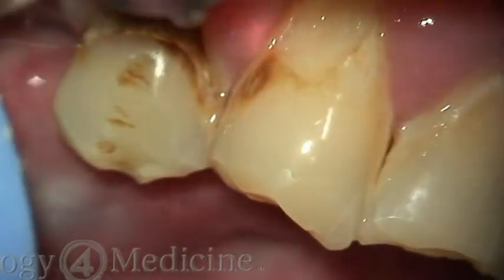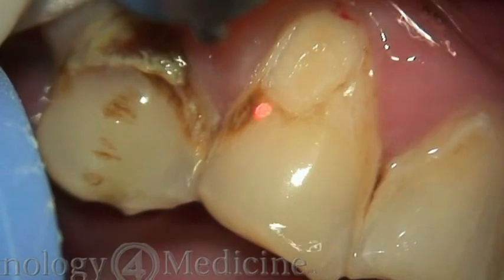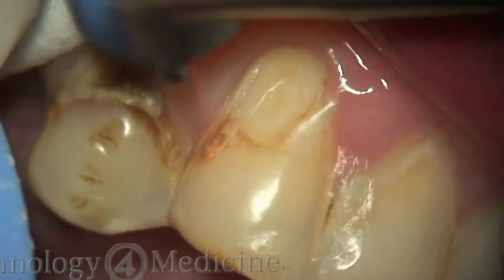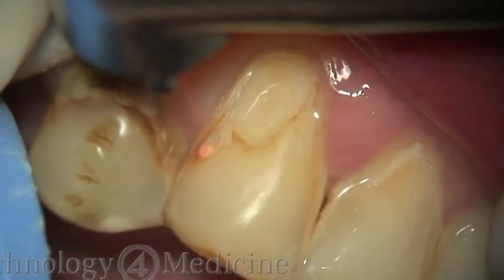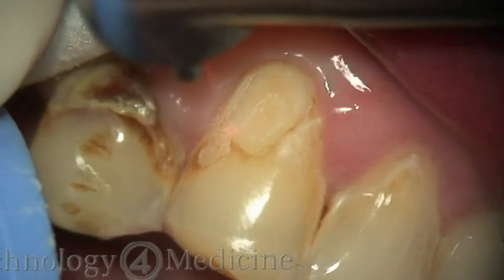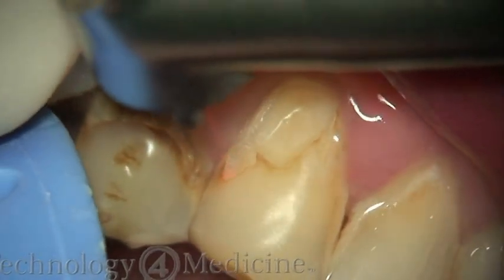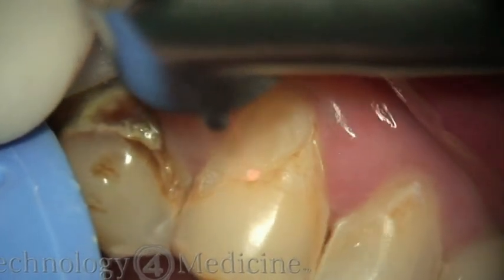Because we don't use a topical or local anesthetic, one of the advantages is that I can do multiple restorations — not only in the same quadrant, but in other quadrants as well — which allows maximum productivity for the patient. They don't have to come back for multiple visits, it opens up chair time for other patients and procedures, and for me it's a great return on investment.